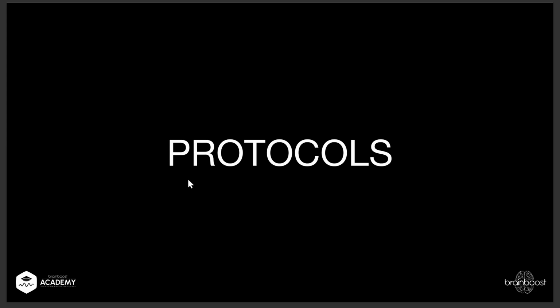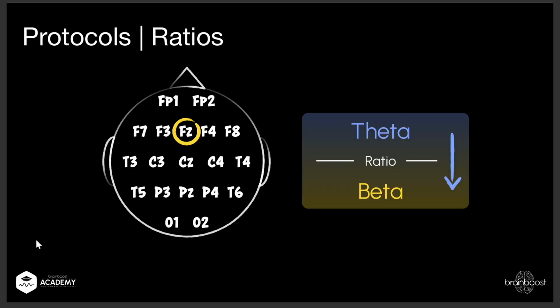So now what is the new advanced cool thing? The more people we have using the Brain Assistant, and it's quite a few, the more they, of course, have nice, cool ideas, the more they discover and do new brain mappings and read studies. So what they also ask us is this: how about a ratio training, theta beta ratio, for example, in the frontal area, right? So to lower theta, right? And to have more beta.